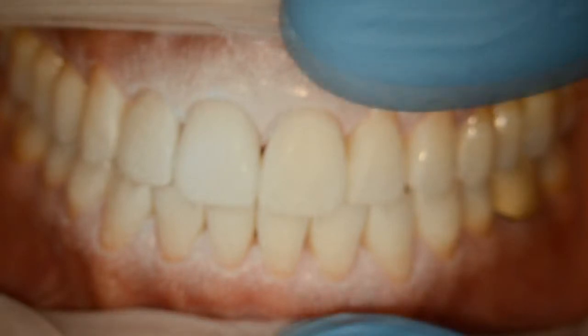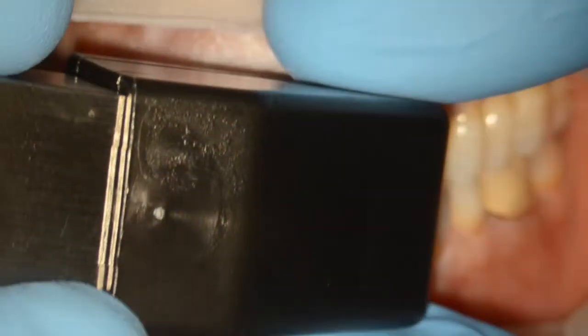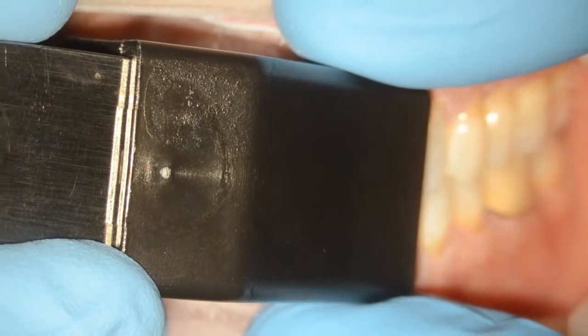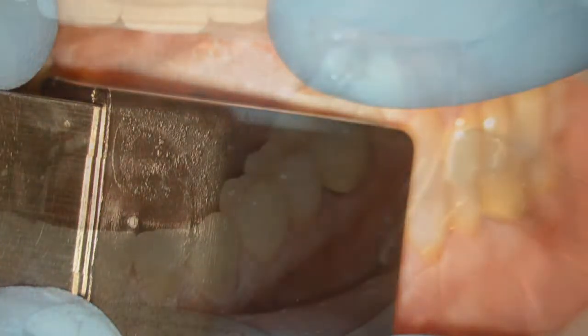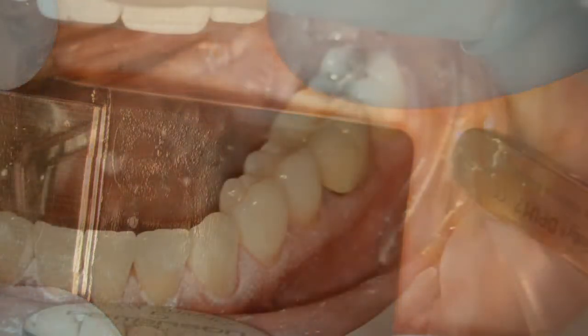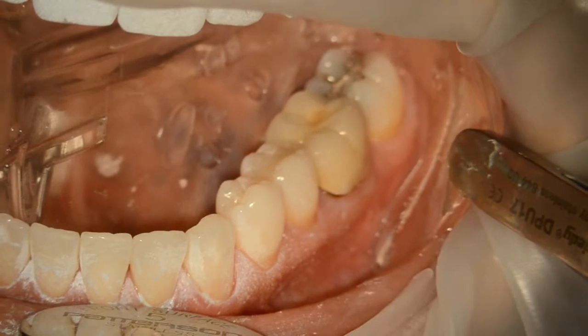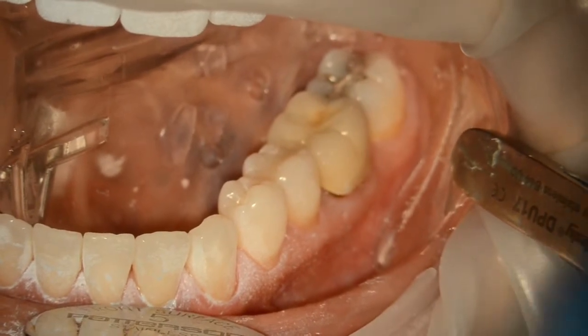It's very critical that we get enough landmarks from the facial of the upper jaw and lower jaw, particularly the area from the central to the lateral, so you have very solid landmarks for stitching purposes so they can relate the upper jaw to the lower jaw.